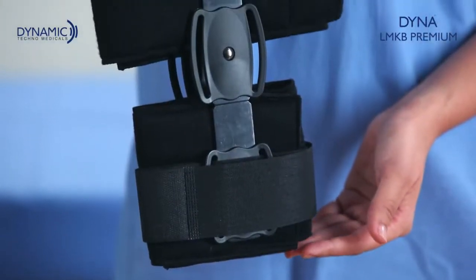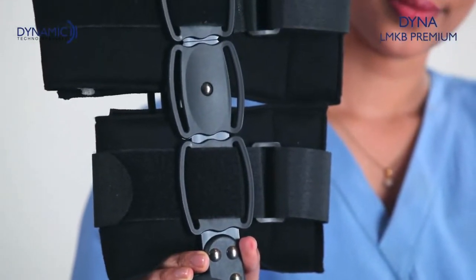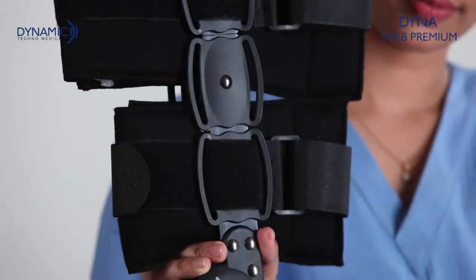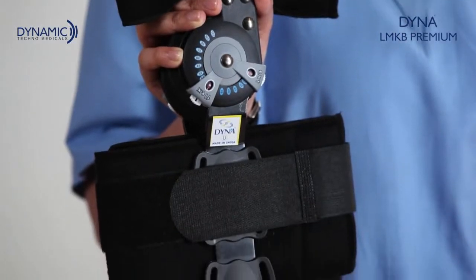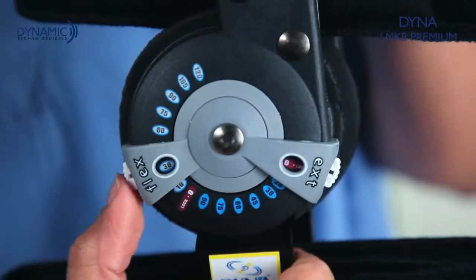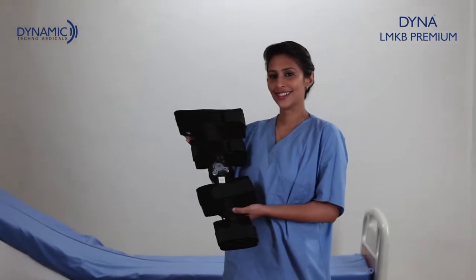Dynamic Techno Medicals presents the Dyna Limited Motion Knee Brace Premium for step-by-step recovery of the knee in post-operative conditions. The Dyna LMKB Premium has thigh and calf bands for proper fitting and medial-lateral metal bars for immobilization. It provides desired range of motion with individual angle adjustments through a flexion-extension setter.